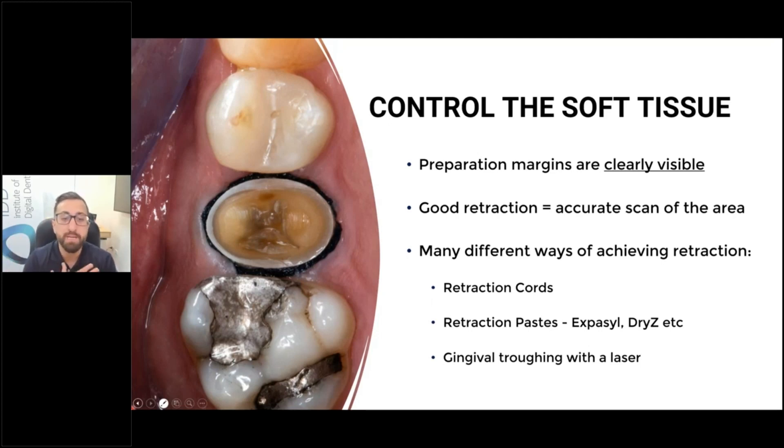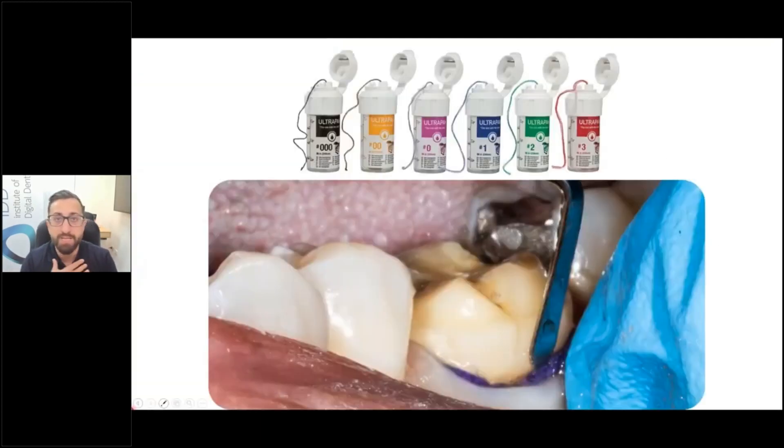In my opinion, soft tissue control is probably the number one thing to really master. What I mean by that is good retraction of the gingival tissue around your preparation. There are many different ways of doing this: retraction cord, retraction paste, gingival troughing. Honestly, I don't get too fancy. I just use retraction cord — 99% of my cases is just retraction cord. And I'll use quite a large retraction cord.